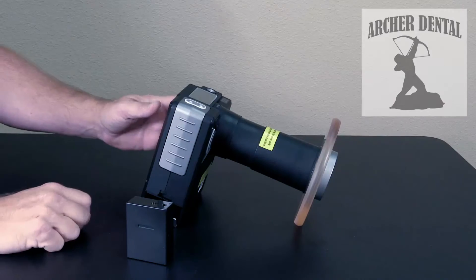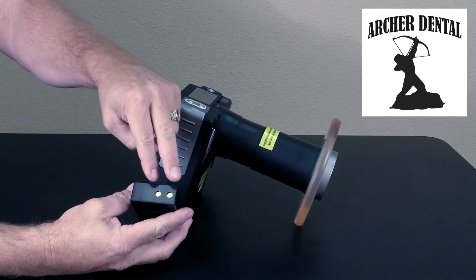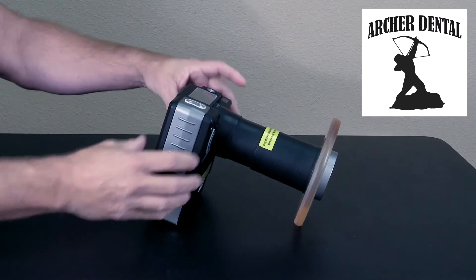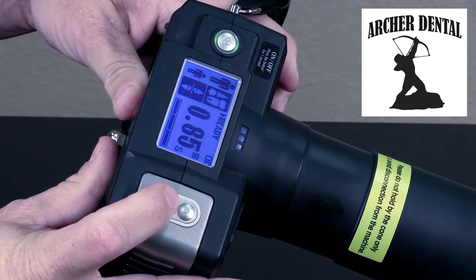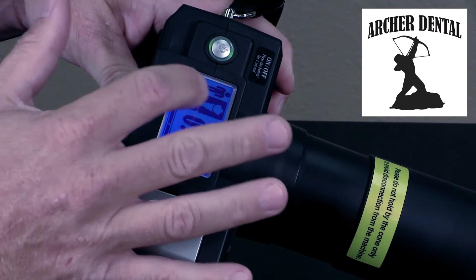The MaxRay is very simple to use. Simply insert your battery contacts first into the battery chamber and close the door. Hold the on/off button until the unit turns on. Once on, you can select from two settings: adult or child.